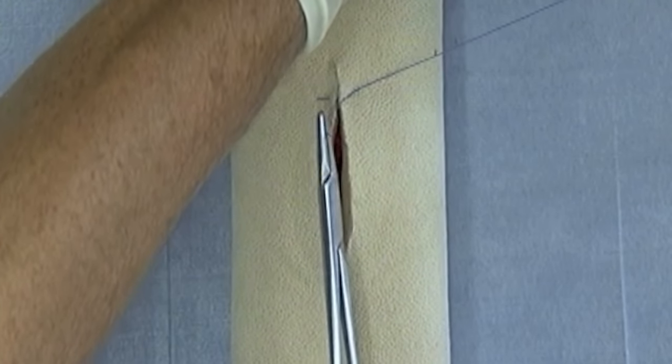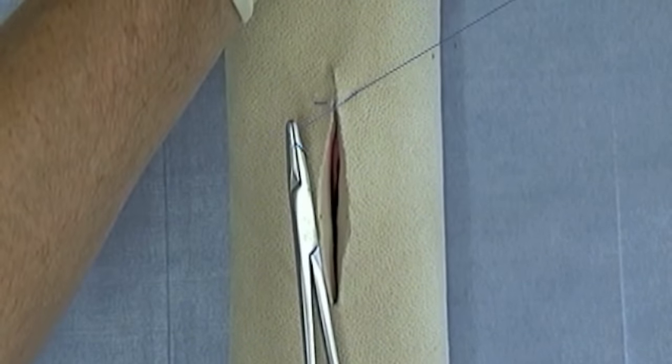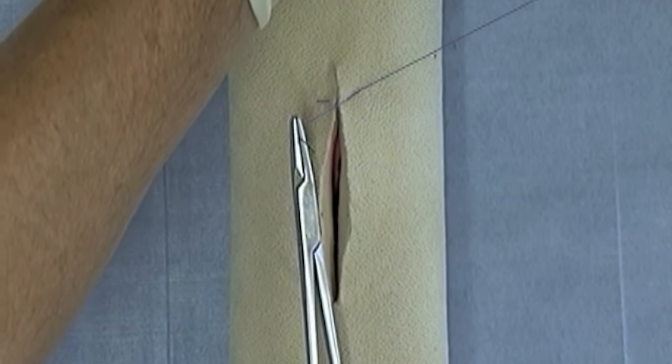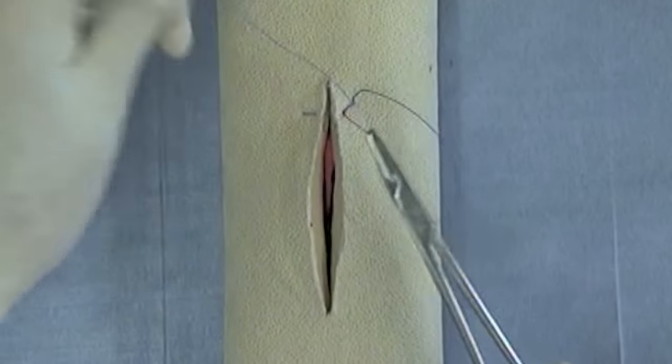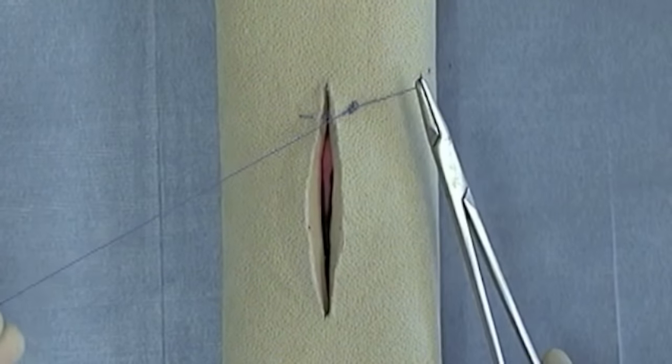Now it's hard to maintain the correct tension, but both the vertical mattress and the horizontal mattress are everting suture patterns, principally used for skin, principally used in areas where there's tension.